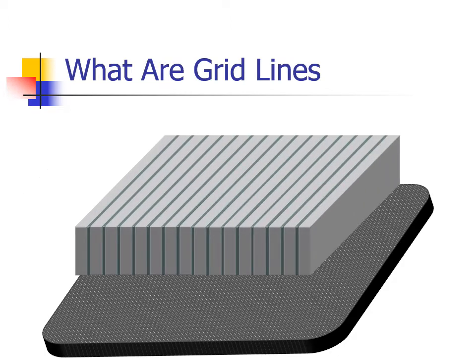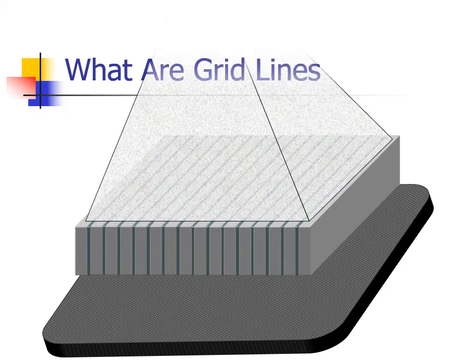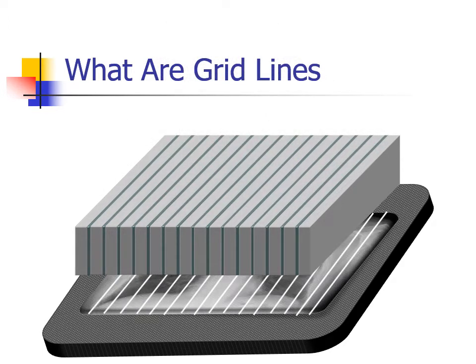Let's place a grid over the imaging plate in an effort to reduce scatter reaching the plate. While the grid allows most of the remnant radiation to reach the imaging plate, a small amount of radiation strikes the lead strips on edge, and the lead strips are recorded as part of the image. For the sake of illustration, my lead strips are white and very large, so they are easy to visualize.